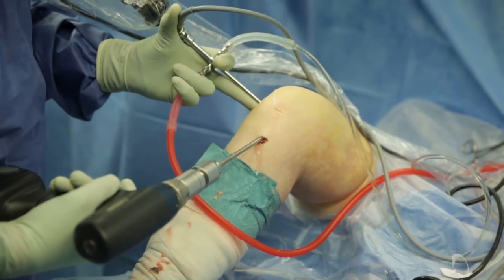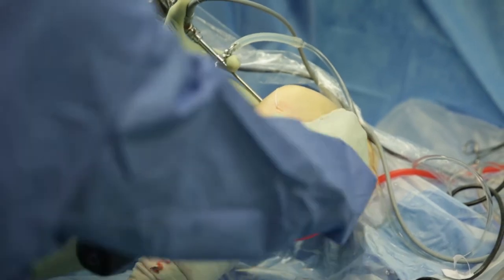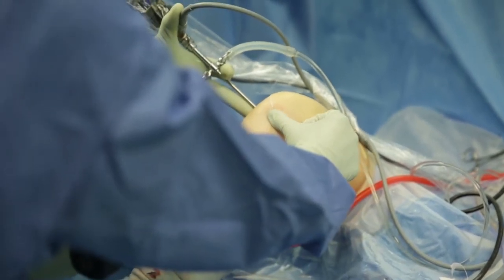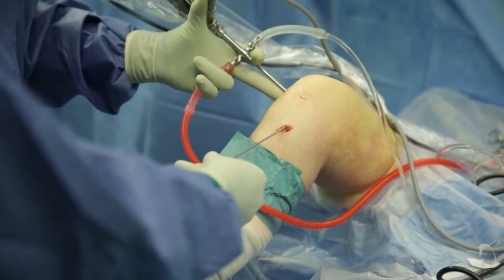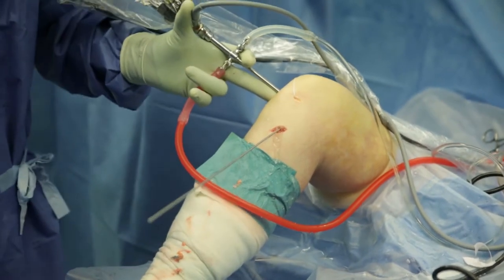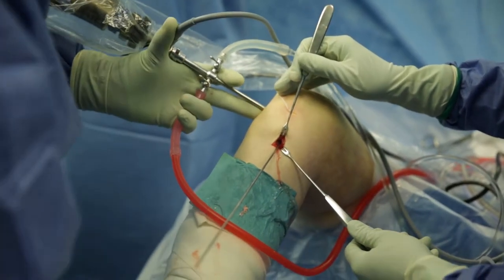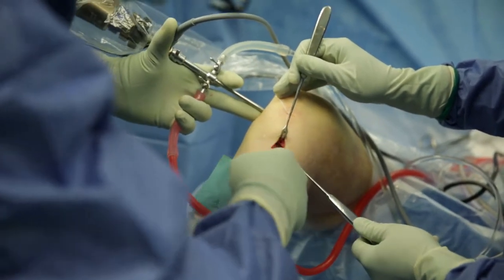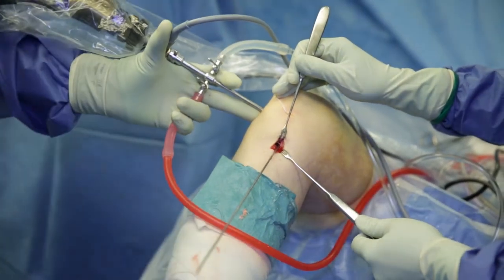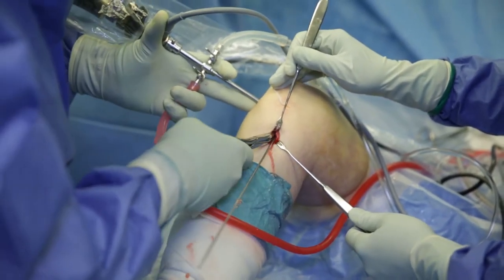Aim is to not enlarge the tunnel more than necessary. So now we clean the entrance of the bone channel to have an easy impaction of the graft.